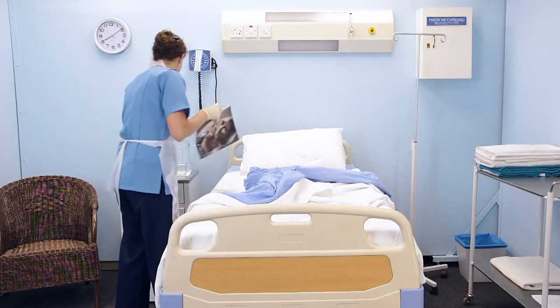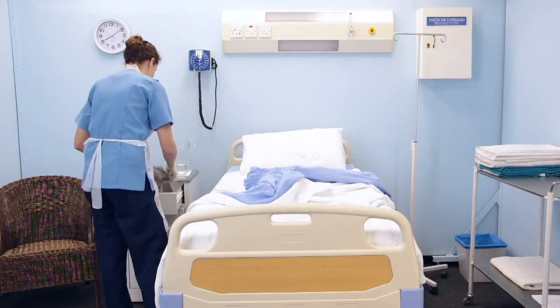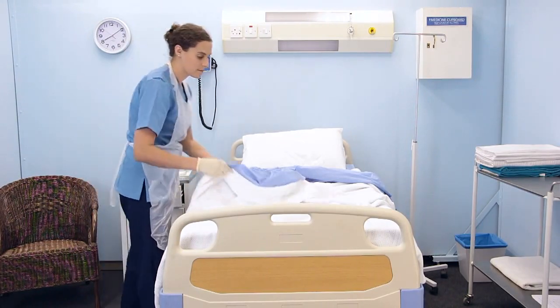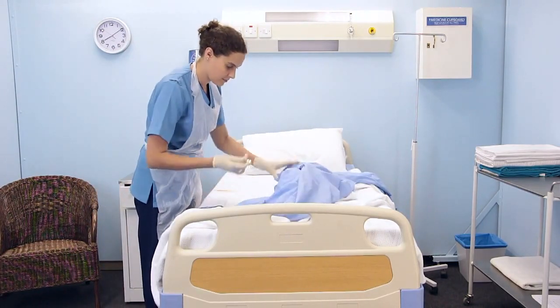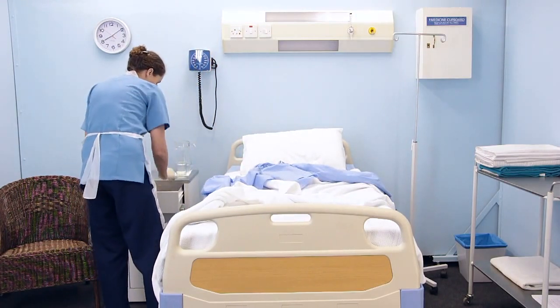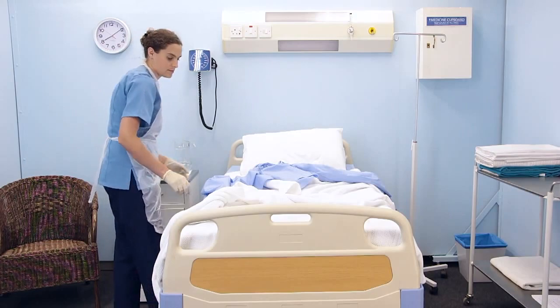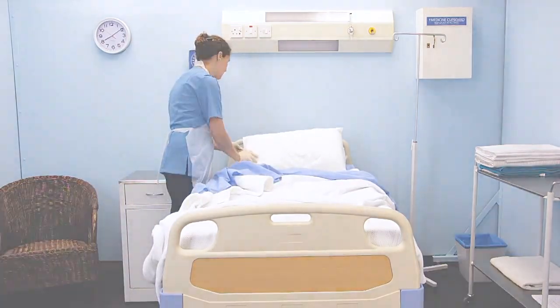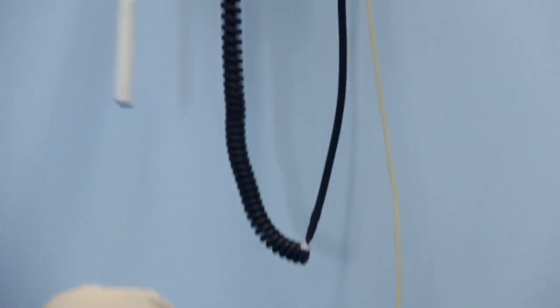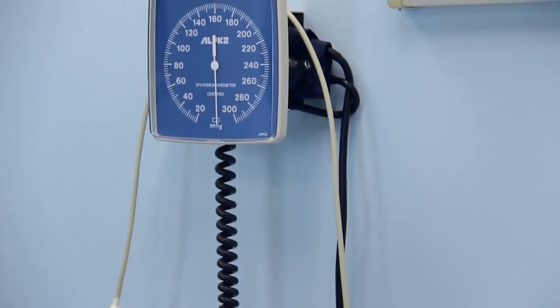For example, eyeglasses, cellular phones, a wristwatch, dentures, or any other personal articles. Remove any items found and place neatly in the patient's bedside locker. Separate the call bell system from its position on the bed.